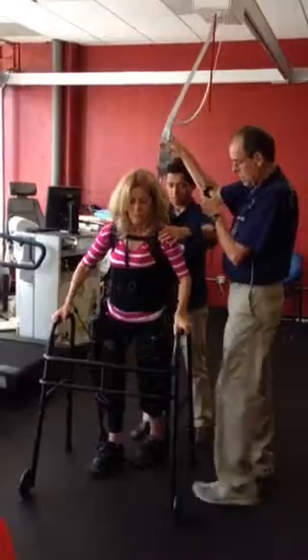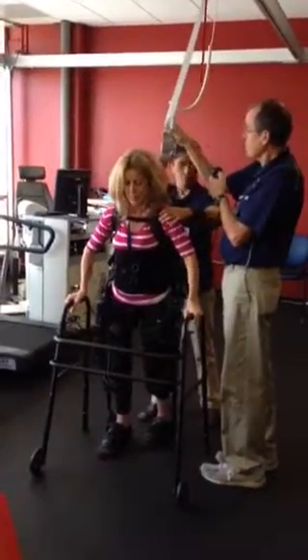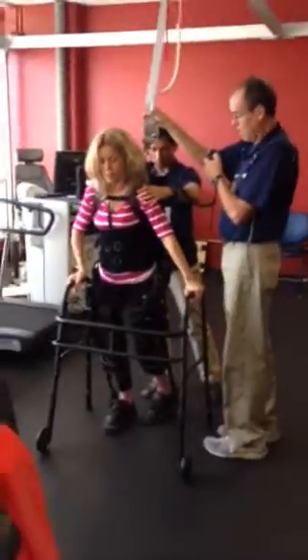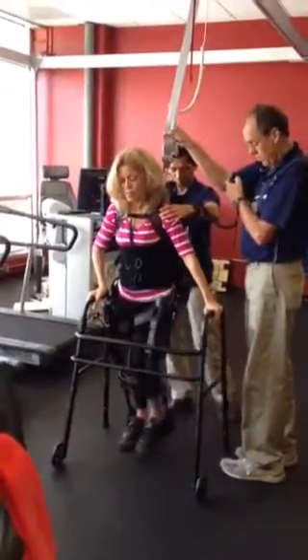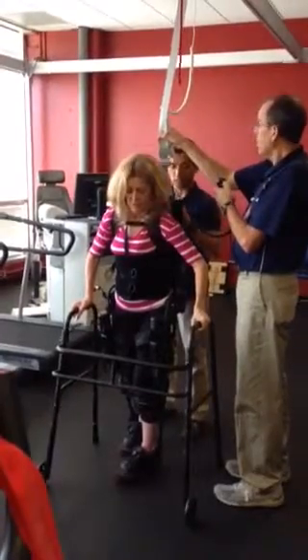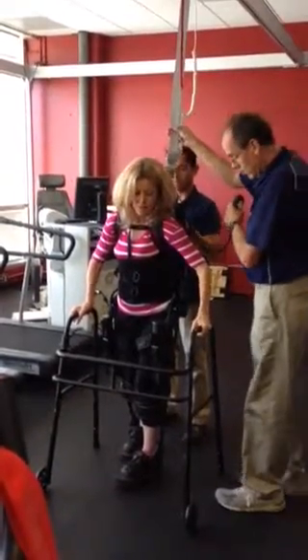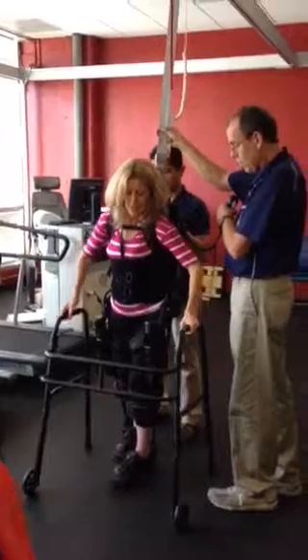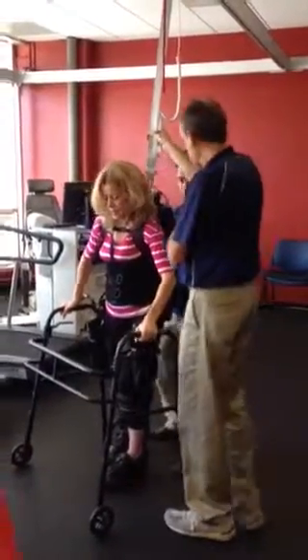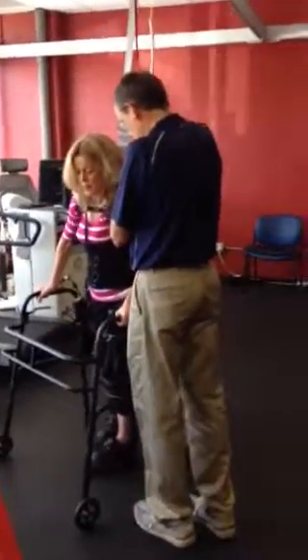Good. Now I'm going to go forward and right. Right there. And step. So we're going to do that dip — remember that dip we were talking about? Yeah. I'm going to pivot to the right, so we're going to slowly turn your walker to the right. There's a pivoting. We're going to help you up. Let's do a dip. One, two, three.